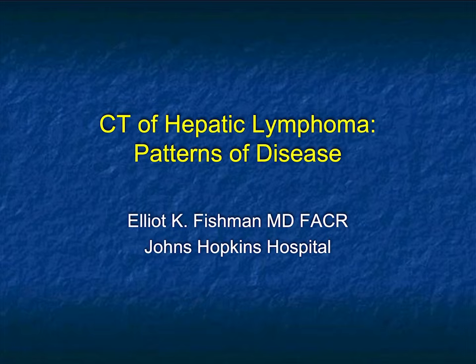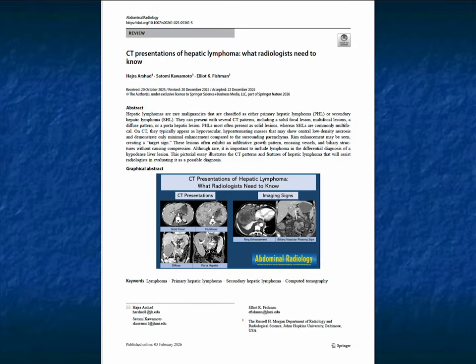And this will be a one-parter on the CT appearance of hepatic lymphoma. It's based on an article that literally was just published by Hajra and Satomi and myself, looking at the appearances of lymphoma on CT and seeing what we can learn.